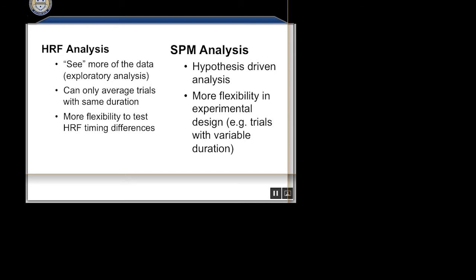Let's say you're working with a population where that HRF is not well defined. Would you still see it as high probability of bias to the data if you took, independent of condition, the population that you're working with and just looked to see where the peak in that HRF was, independent of condition and consistent, let's say, with baseline? Would that still be biased? Well, no.